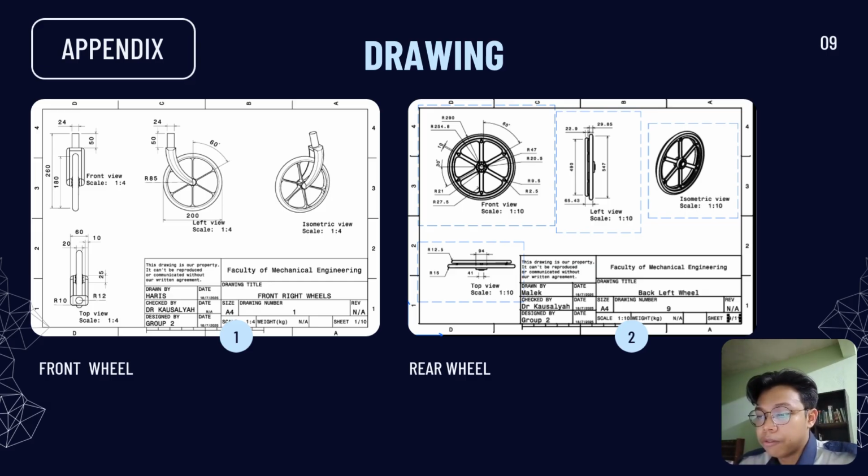So the first drawing, which is the front wheel, we have designed that way based off our research and also the intricate design of it. Based off our research, this is the best design for a front wheel of a wheelchair. And second is the rear wheel of the wheelchair, which is pretty much a wheel with a handle guard for the user to move the wheelchair.